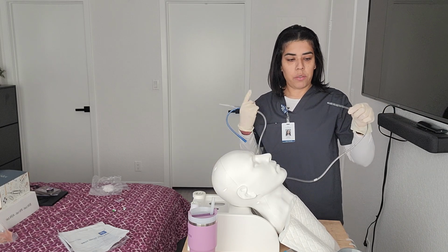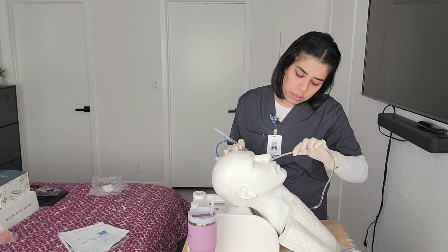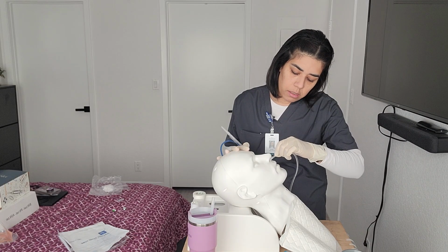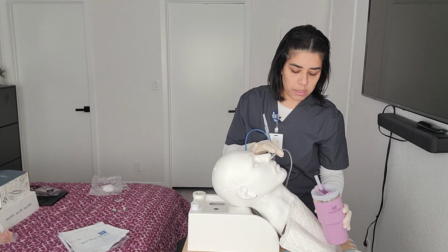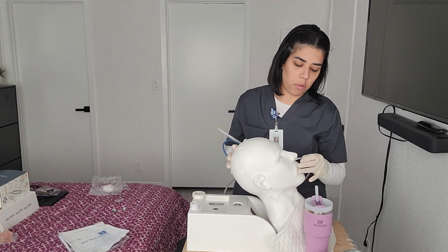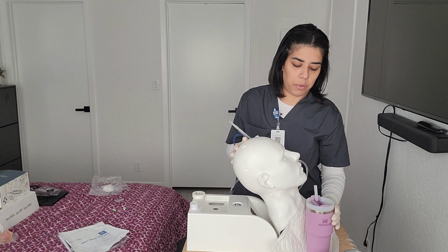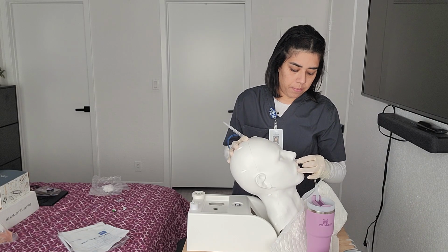All right, sir, so here we go. Ready? 1, 2, 3. I know, I'm sorry. All right, sir, so now he's having that gag reflex, so he's gonna start taking sips of water. He's gonna tilt his head forward, and we're gonna continue to insert as he takes his sips of water. All right, perfect. All right, sir, you're doing okay?